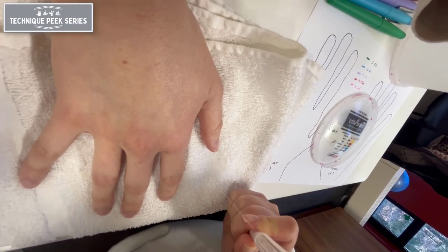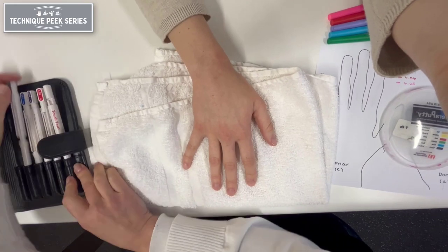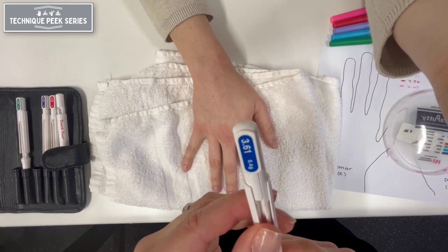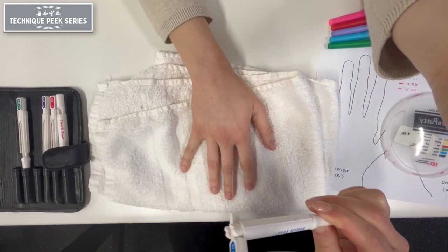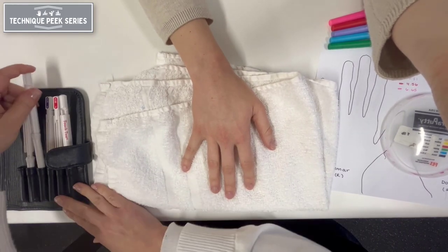When testing, press the filament at a 90 degree angle against the skin until it bows. Hold in place for 1.5 seconds and remove. You should apply the stimulus in the same location up to three times to elicit a response. A single response indicates a positive response.